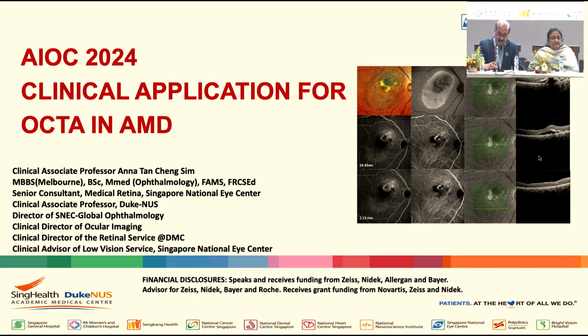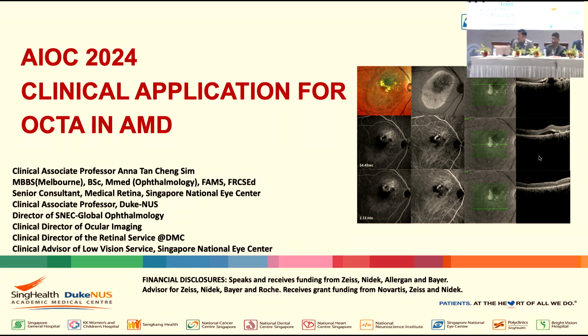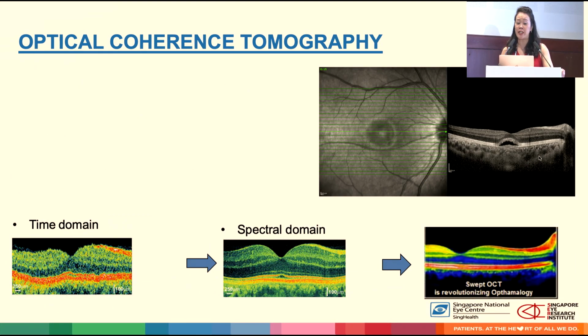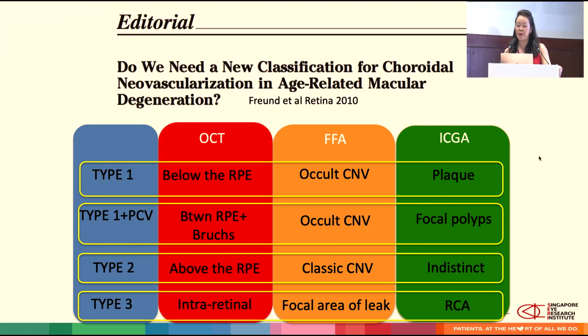Hello, thank you so much for having me here. It's my first AIOC in person. I've done a lot of webinars, but it's so nice to be in person here in India to talk to you about OCTA and AMD. I think the previous speakers already introduced OCTA. We know that OCT has really transformed our clinical management all the way from the days of time domain to swept source now.